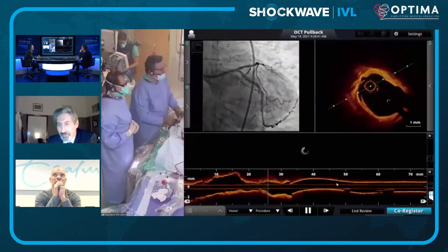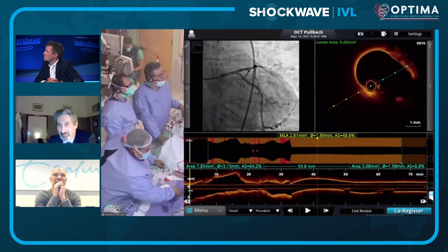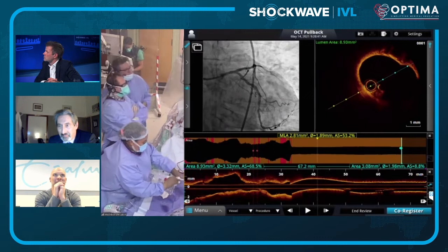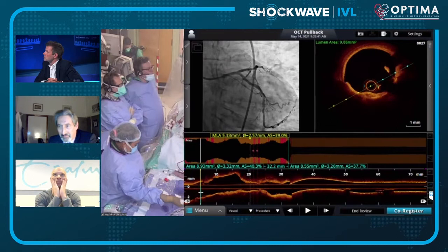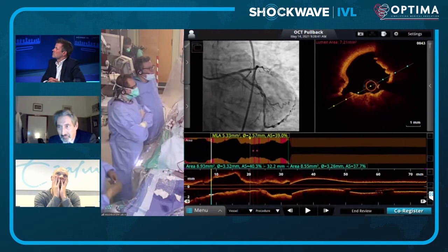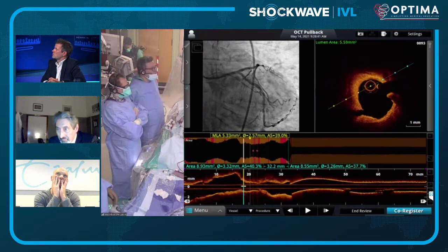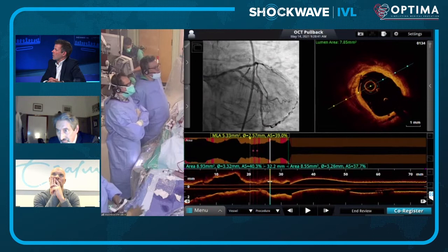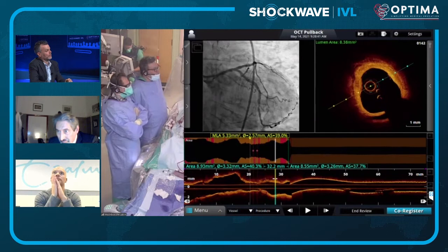Richard reviews the post-shockwave OCT systematically: looking for fracture, landing zones, and length, then finding a good landing zone and placing markers. The vessel size is getting bigger and the length longer — they love to measure post-shockwave. Scanning for fracture, there is impressive fracture visible at around 5 o'clock and multiple areas with nice fracture. Back in the left main, the MLAs have dramatically improved — at the ostium from around 2 mm² up to about 6 mm² just with a 4 atmosphere balloon, demonstrating that cracking circumferential calcium opens the ring dramatically.